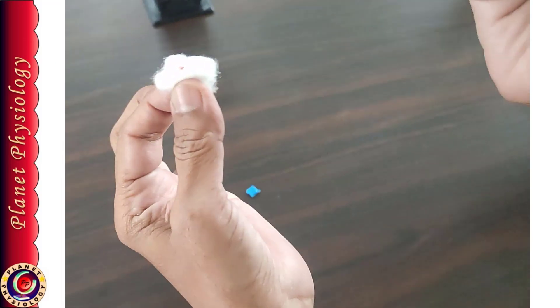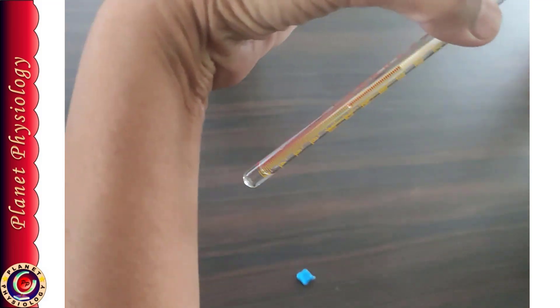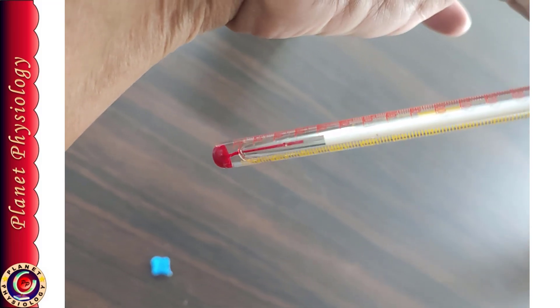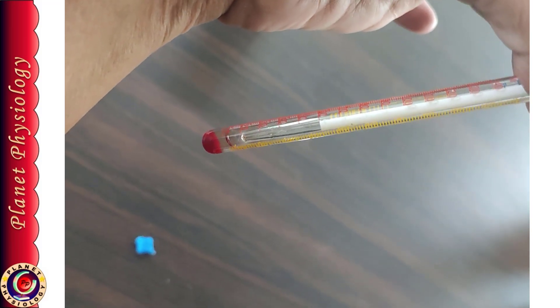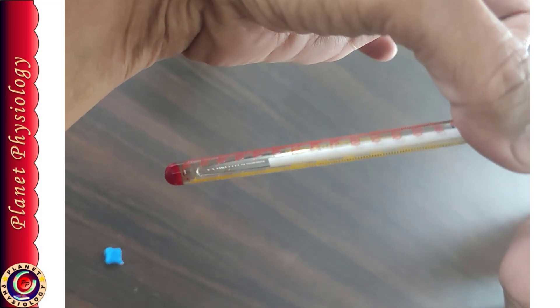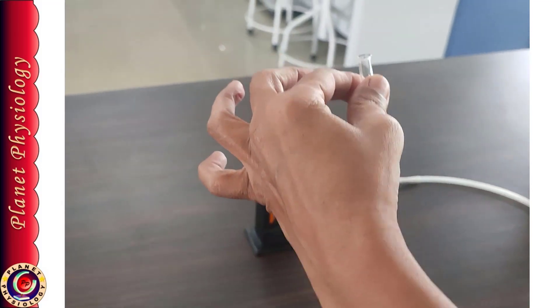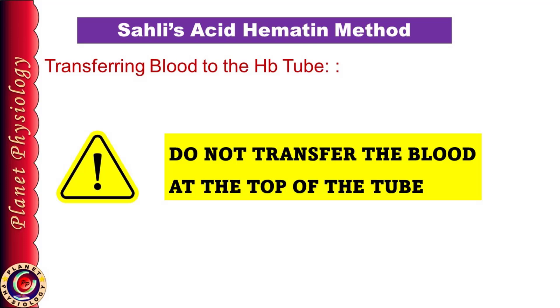Once the blood sample is collected, wipe off the blood from the tip of the pipette and immediately transfer it into the hemoglobin tube. Insert the pipette till the end of the tube and blow out the blood sample into the acid. Rinse the pipette gently by drawing the acid and blowing it back into the tube 2 or 3 times — this transfers the entire blood from the pipette into the tube. A common mistake is blowing out the drop at the top of the tube, which doesn't transfer the entire blood sample into the acid and gives a false lower value.